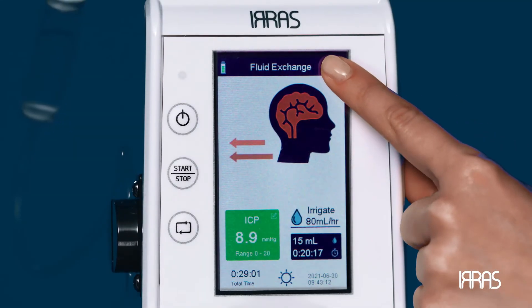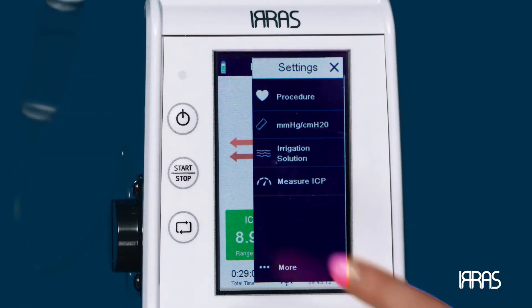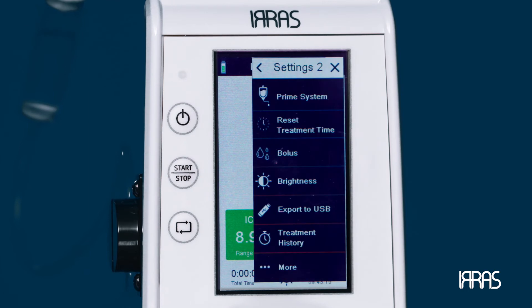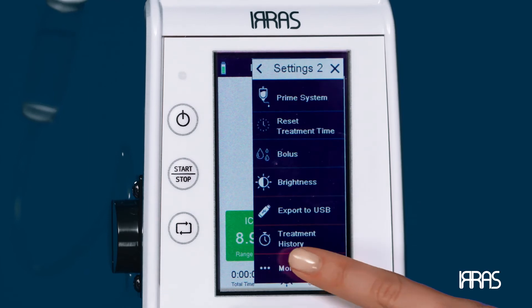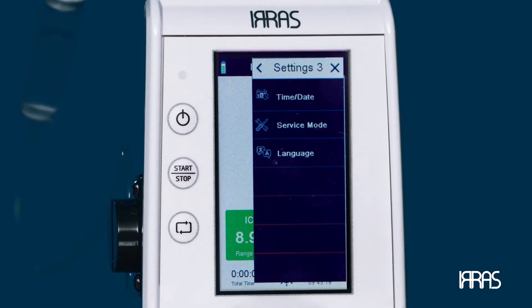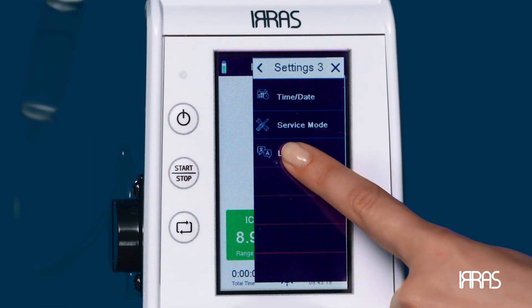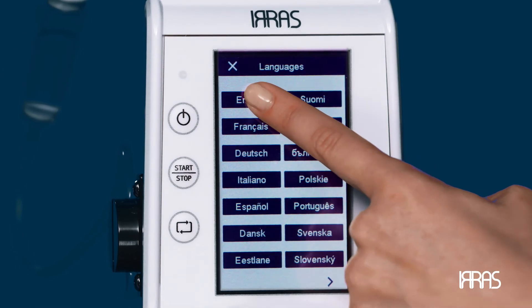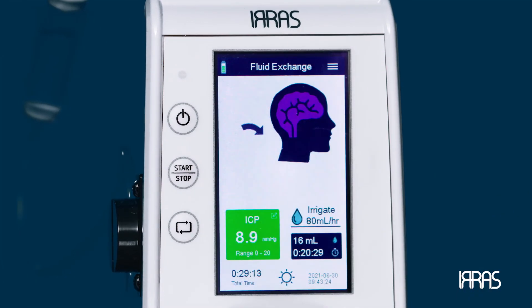Language — to change the language of the control unit, press the settings menu, select the language option, and choose your desired language. Once set, return to the main screen.